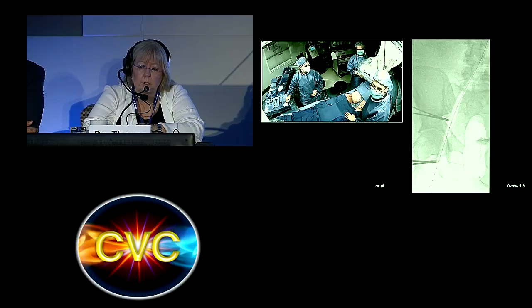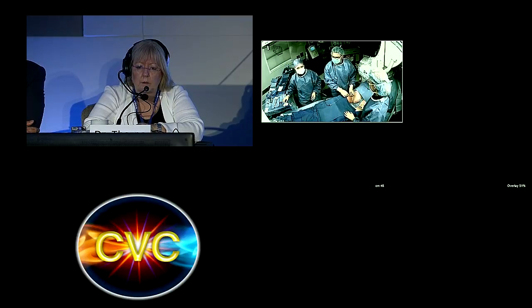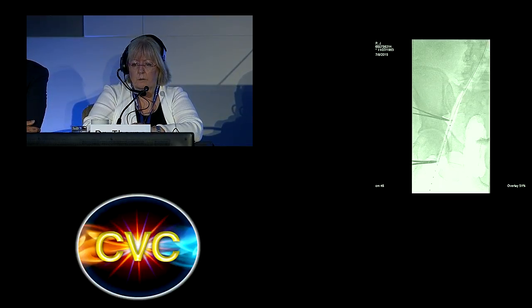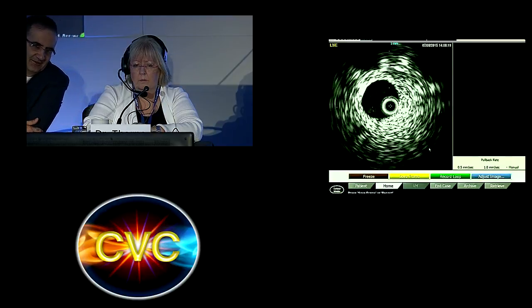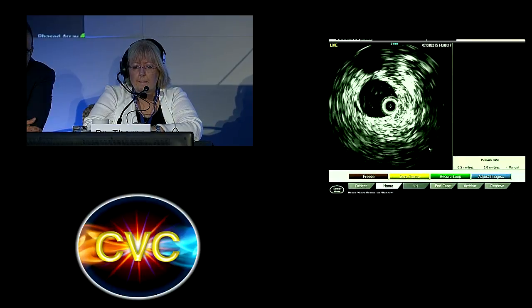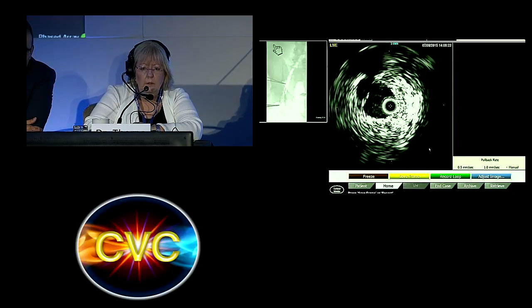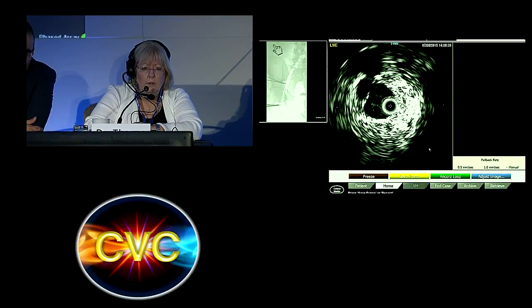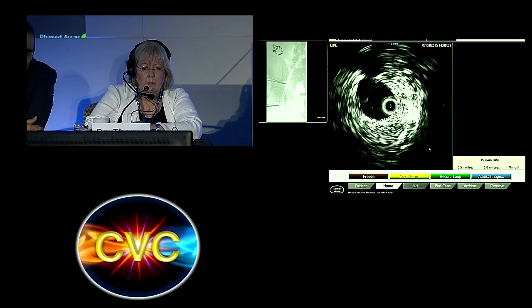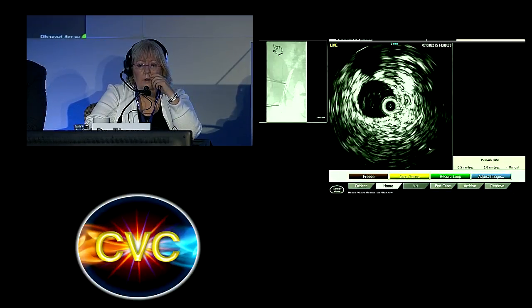See, right there. I think there's a... Julio, I really think there's a lesion above that. Even above? Okay, well, let's go back to the IVUS here. I'm right there where the mosquito is at the top. That vein looks pretty clean to me. And even if I pull down some more, I start seeing the changes happening just right there. Right there, yes, I can see some fibrotic. Actually, there's a little flap right there from perhaps the angioplasty. But above this level, Dr. Thorpe, I think it looks pretty clean to me.